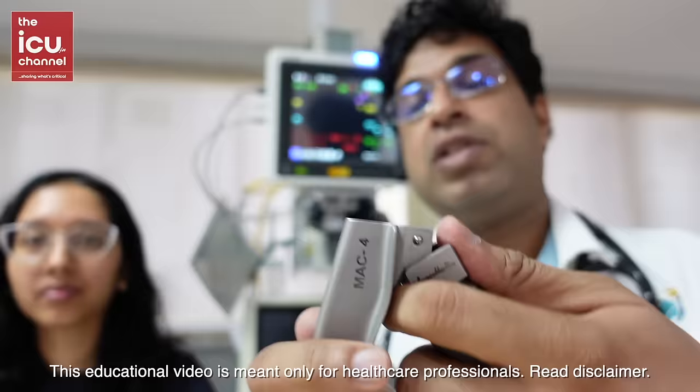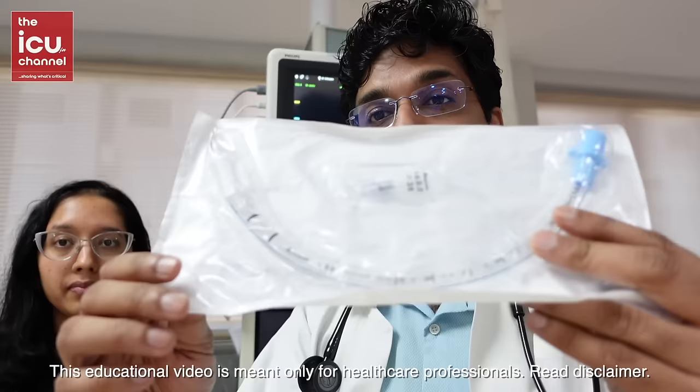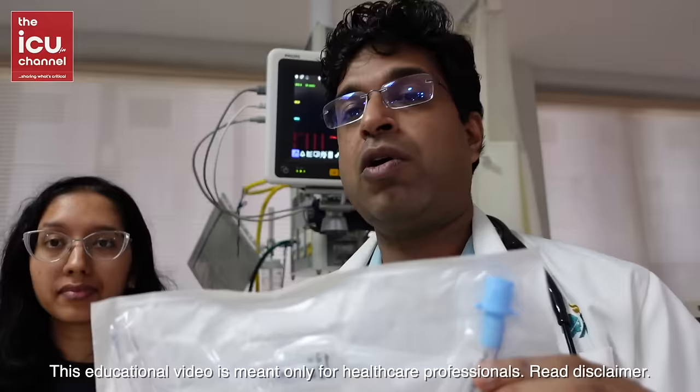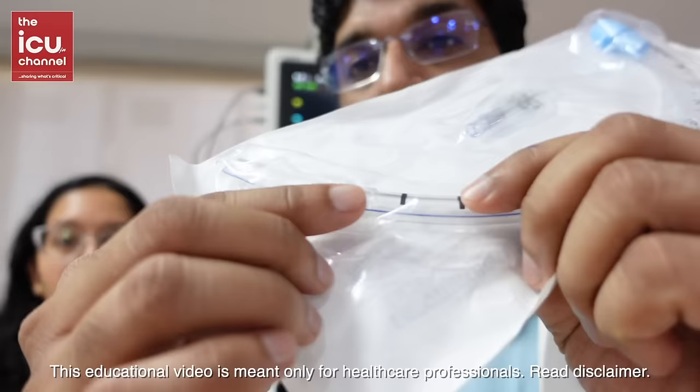This is the endotracheal tube — it comes in different sizes. Commonly used sizes are 7.5 for females and 8 to 8.5 for males. You can see the number written on the tube — this one is size 8. There are black markings on the tube — these black markings should pass inside the vocal cords. This is how you intubate the patient.